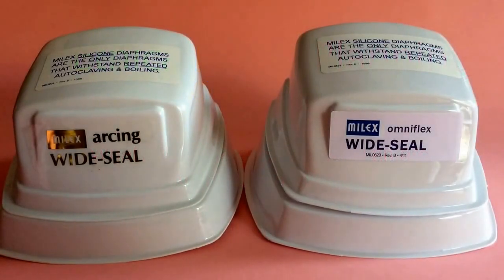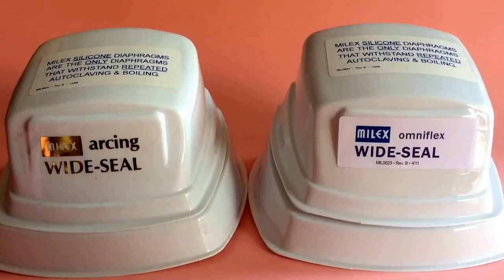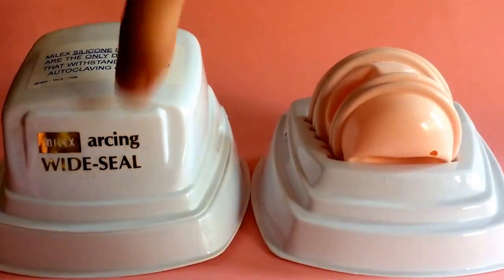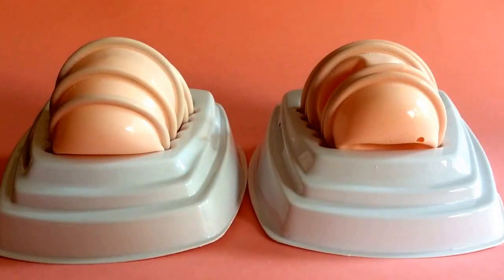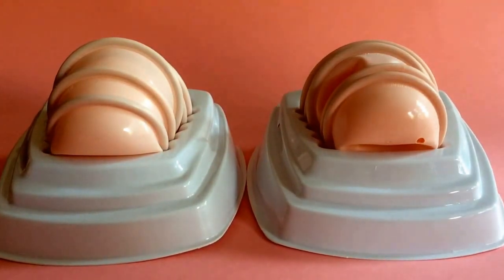Hi, this is David from Ethical Family Planning showing the difference between OmniFlex and Arcing diaphragms. To show the difference we're going to use these fitting kits. Fitting kits are used within clinics to help fit a woman for the correct size diaphragm, which must always be done. Basically it's a collection of five diaphragms in different sizes, and just through simple trial and error you can work out which one fits correctly and therefore determine the size.